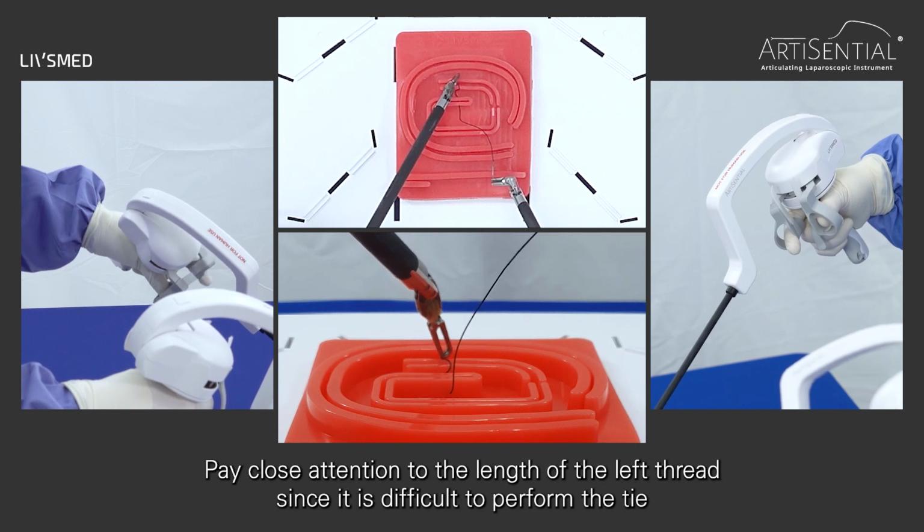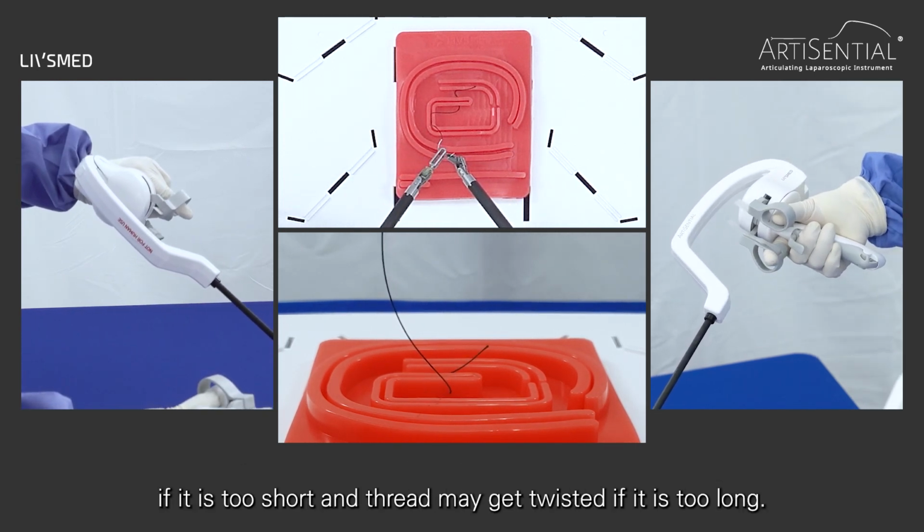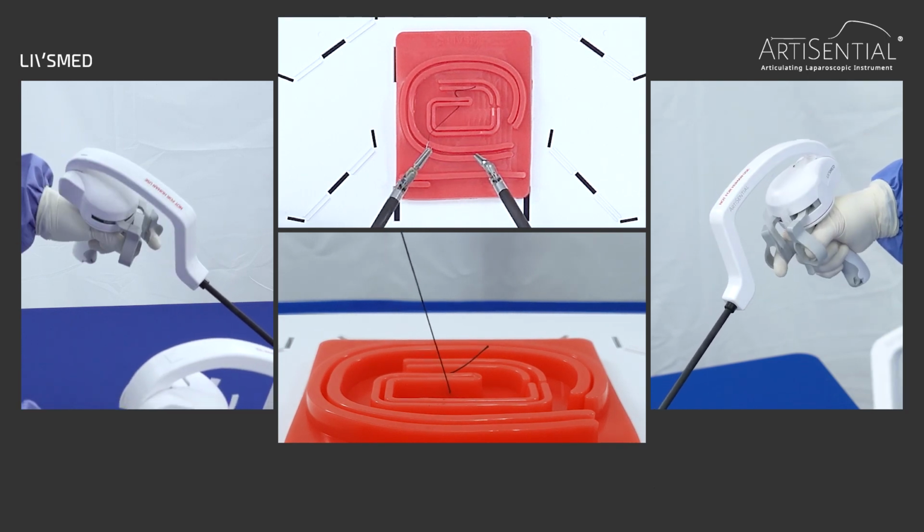Pay close attention to the length of the left thread, since it is difficult to perform the tie if it is too short, and the thread may get twisted if it is too long.